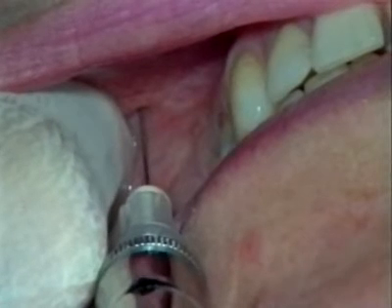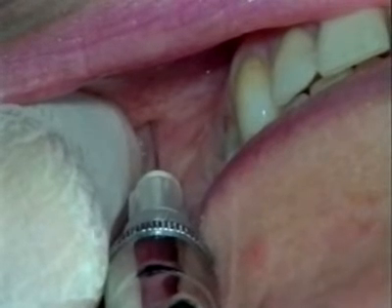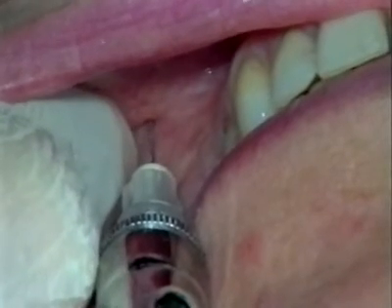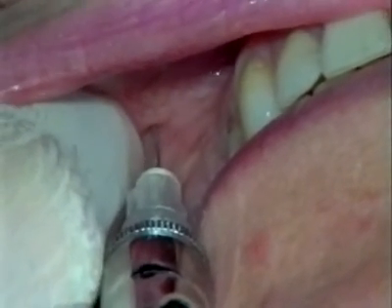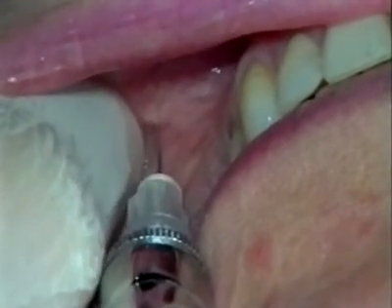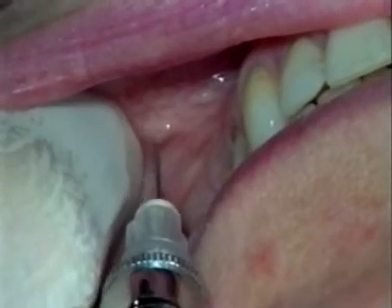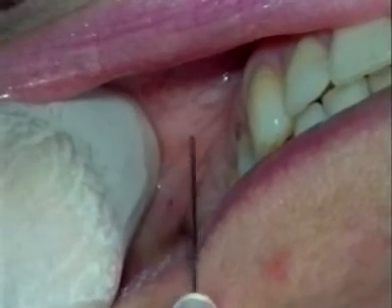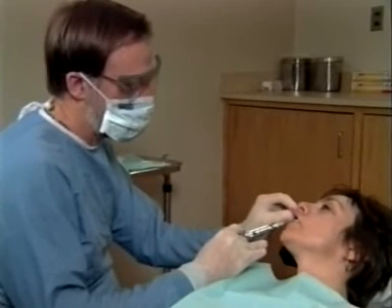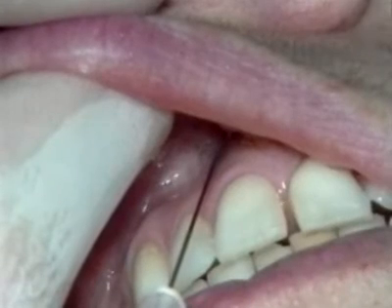The average depth of penetration is about 15 millimeters. After negative aspiration, injection is made with the palpating finger remaining in place to help guide local anesthetic solution into the infraorbital canal. A total of 1 milliliter, or about 1/2 of a dental cartridge, is injected slowly. As with all other injections, the needle is then slowly withdrawn. Because of crossover fibers from the contralateral side, anesthesia of the central incisor may be incomplete unless a supraperiosteal injection is made over that tooth.